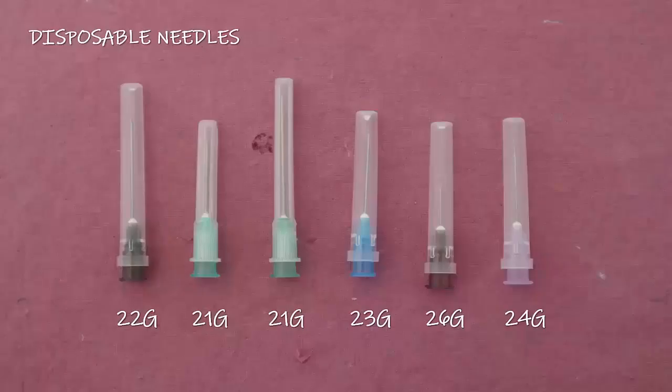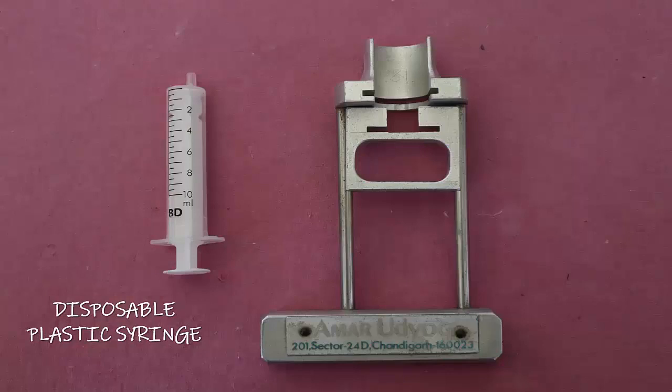Let's look at the equipments that are used for an FNAC. The most important instrument is the standard disposable needle, ranging from 22 to 27 gauge. We use the 25 gauge needle for most lesions, but 27 gauges are used for vascular tissues such as the thyroid. 22 gauge needles are used for deeper biopsies. Next is the standard disposable plastic syringe, which is mounted on a syringe pistol. Here we use a 10 cc plastic syringe.